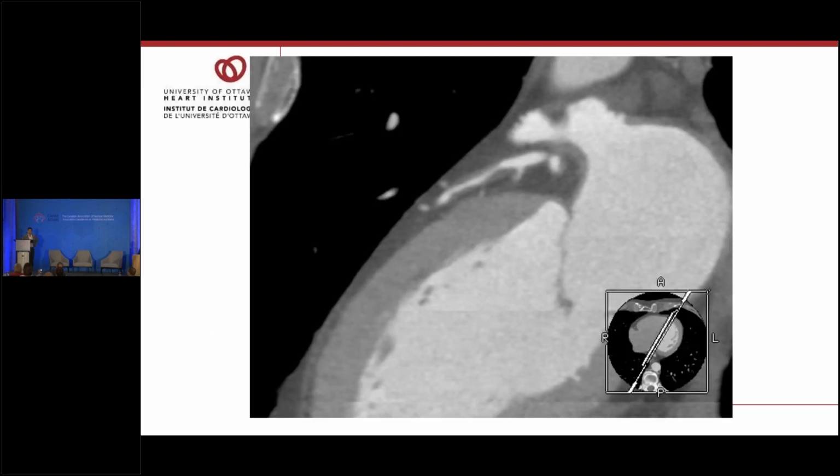But the other thing on the graph, if you looked very closely, is atherosclerosis, and we're actually able to identify patients with coronary atherosclerosis. So here's an image of a different patient with an LAD, and if you do a short axis slice in the center picture, in the center there's a round white structure, which is considered relatively normal lumen, at least in size. And then if you look to the right, that lumen is much, much smaller. That white is much, much smaller, but surrounding it is this gray, and that gray is non-calcific coronary atherosclerosis.